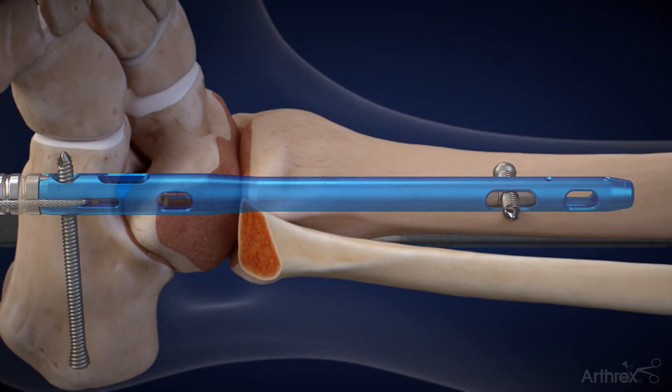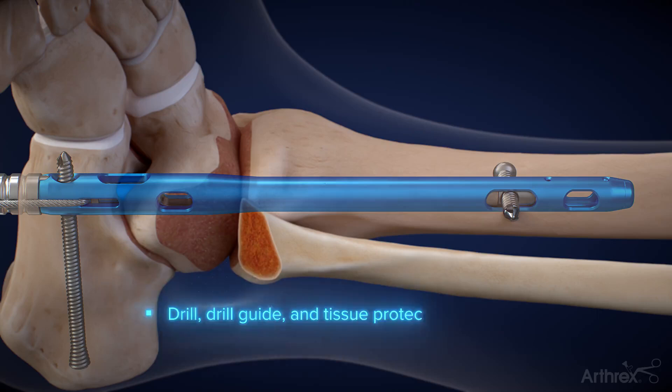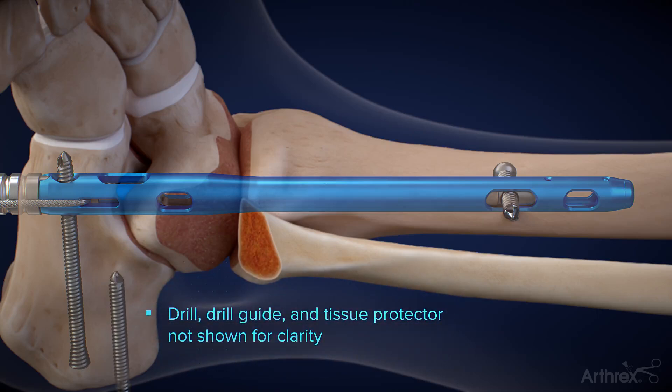Once it has been fully seated, the second posterior to anterior calcaneal screw is inserted to lock the distal slider in position and maintain the compression across the joint.